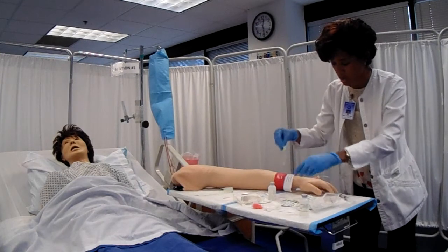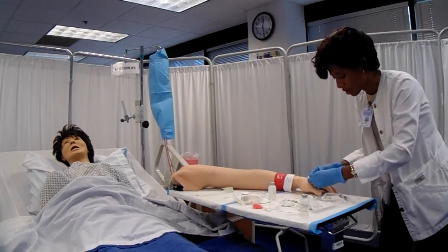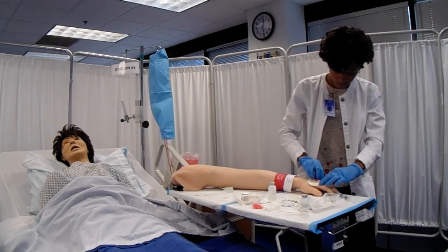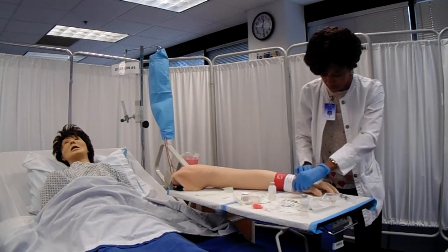So I'm now going to go ahead and secure the site with my op-site dressing, making sure to cover the hub of the tubing as well as the entry site of the catheter. Miss Cyrus, you're doing great.